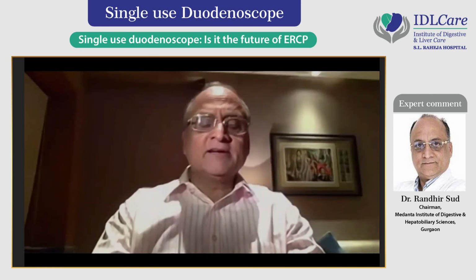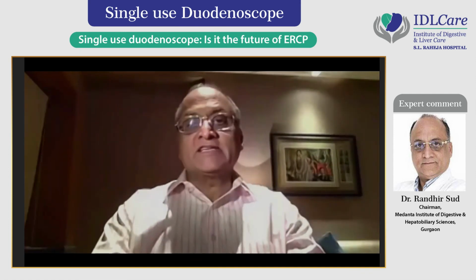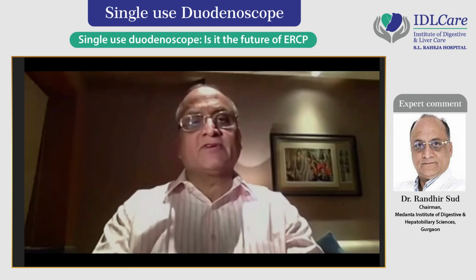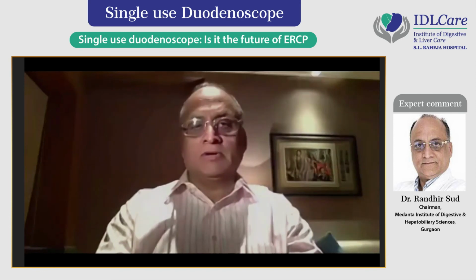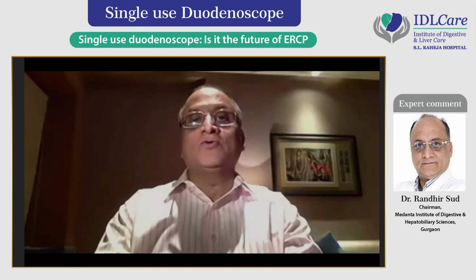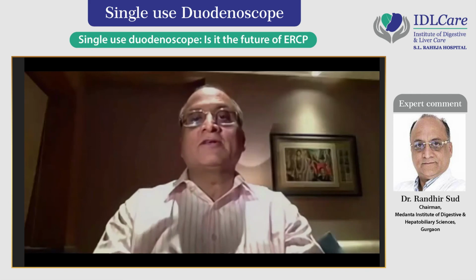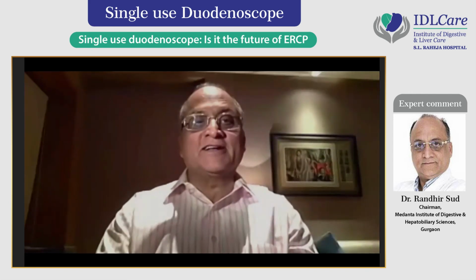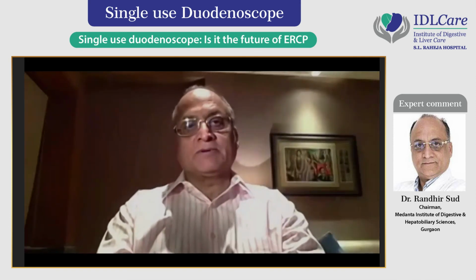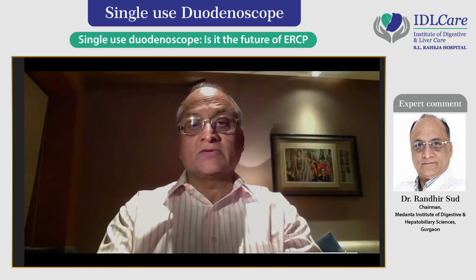So I think we need to take cognizance and invest in that aspect very heavily. I did a personal survey, and we are going to make it into a project to ask our patients whether they would be ready to go for a disposable duodenoscope, if that is available to them instead of the regular one, after telling them the risk of infection and everything. Because we have a high load of post liver transplant patients, it matters how meticulously you do these procedures, because of their incidence of cholangitis.